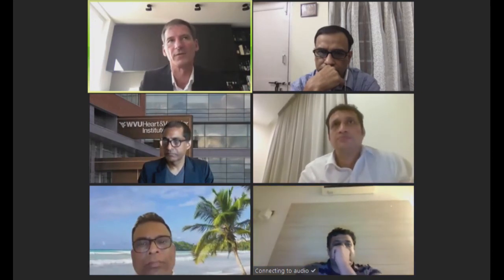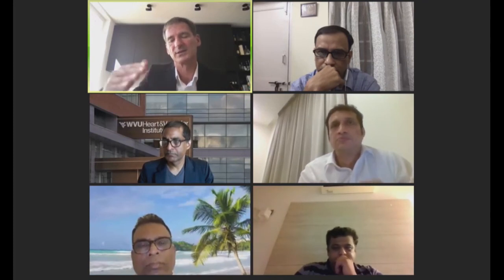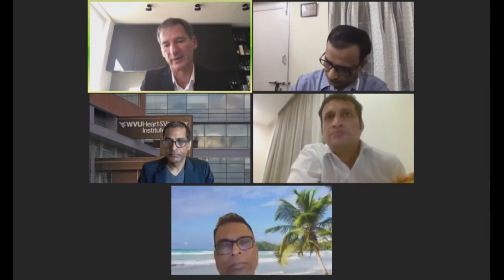And one of the problems that can evolve in that situation is that your umbrella is not deep enough and the disc has no tension, and then you get leaks because the disc is not so flexible and it's just being there, and you have small leaks. So this is to consider for these really difficult or challenging anatomies. Just go in deep enough. The umbrella size is not the most important, but measure your disc size, and that should be oversized by 5 millimeters.